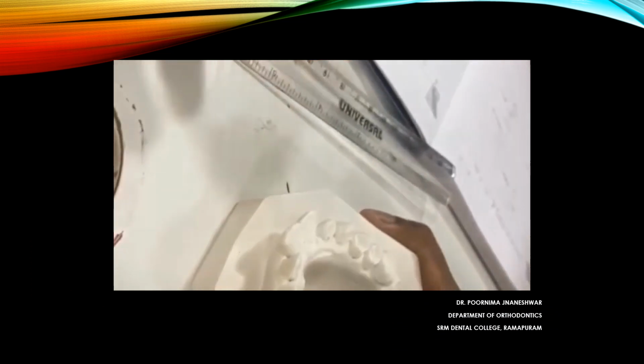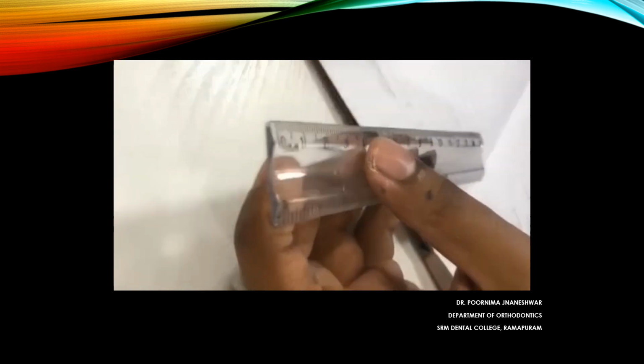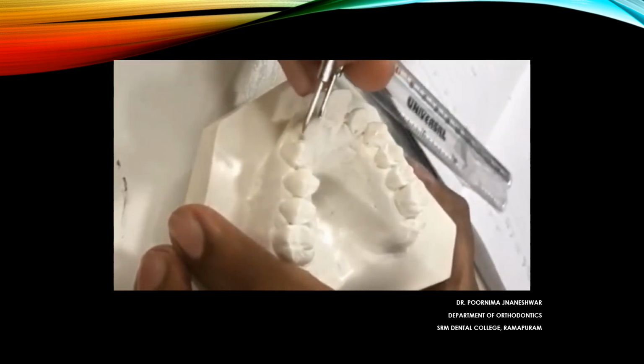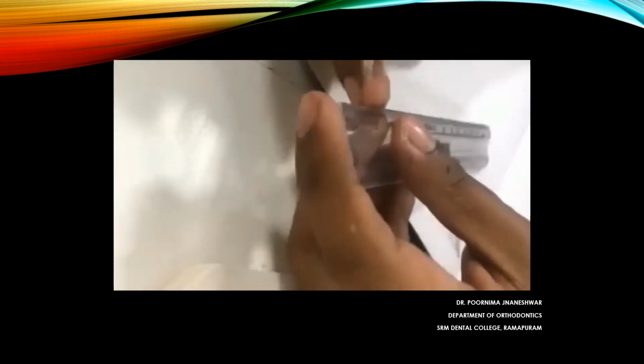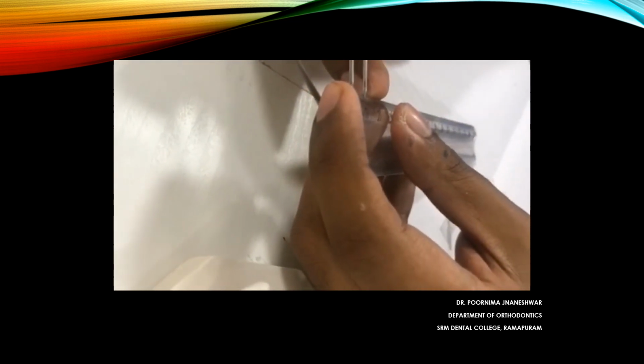Good morning all. Model analysis forms a very important part of diagnosis and treatment planning in orthodontics. This video demonstration brings to you metric measurement of arch length and tooth material done in arch perimeter and Carey's analysis. Arch perimeter analysis is for the maxillary arch and Carey's is for the mandibular arch, and they assess the discrepancy between tooth size and arch length.